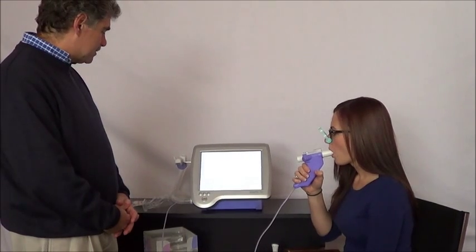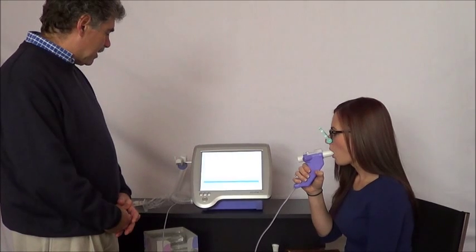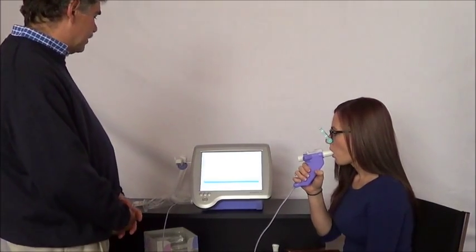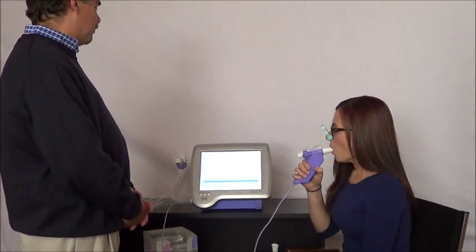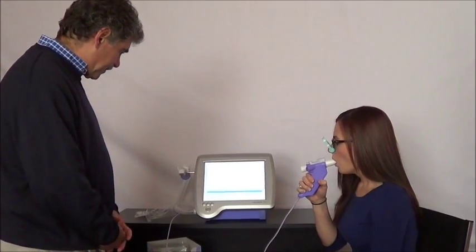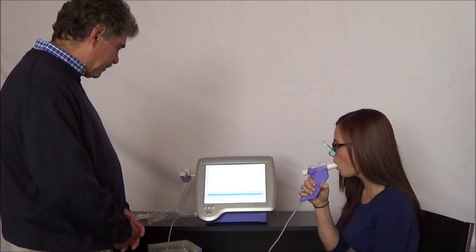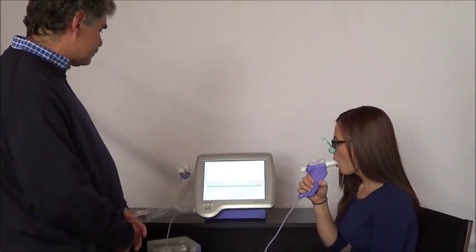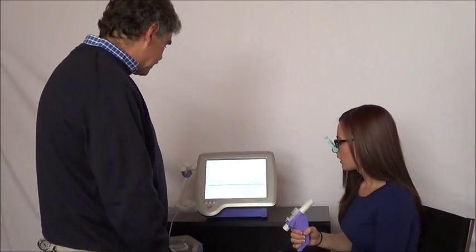Nice and relaxed. When you're ready, go ahead and fill your lungs completely — fill it up. Once you think it's full, a relaxed full exhale. Keep going, keep going, keep going. Very good. That's a good effort, that's a good test.